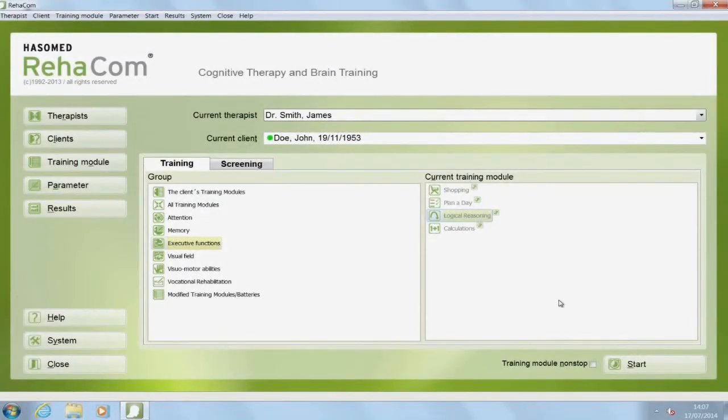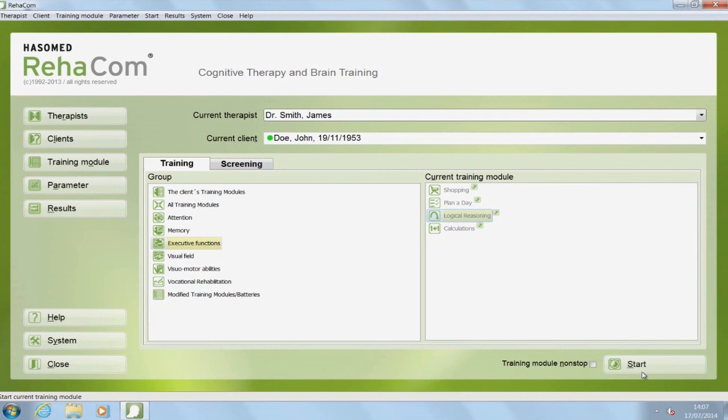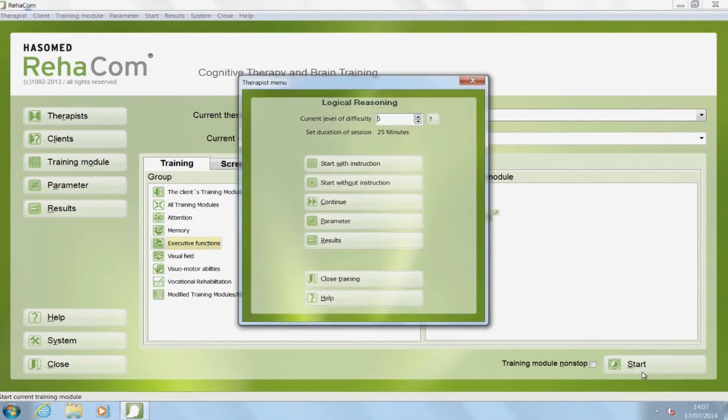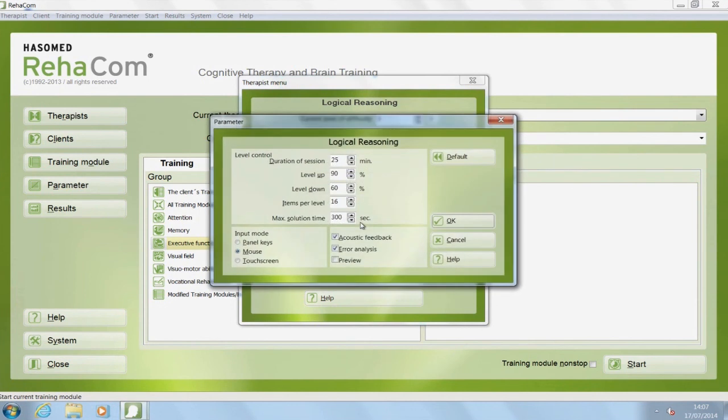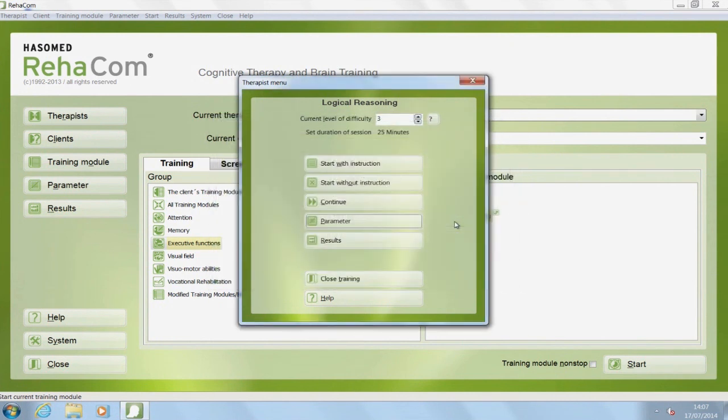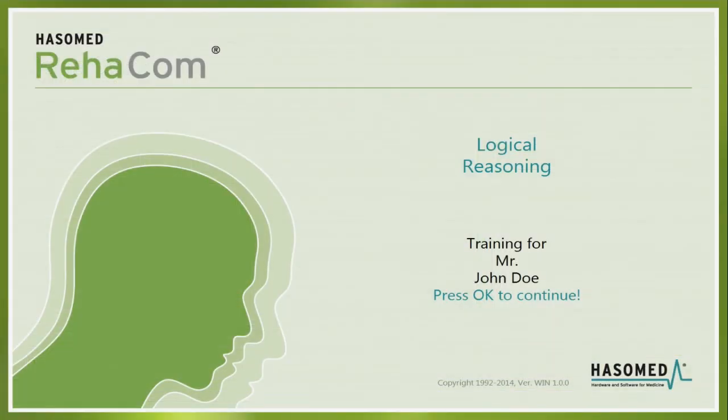Before starting the training module, it is possible to individualize the training parameters. Via the therapist menu, one can adjust the level of difficulty, duration of session, instructions, help or stressors according to the patient's needs. It is possible to change these parameters at any time during the training.